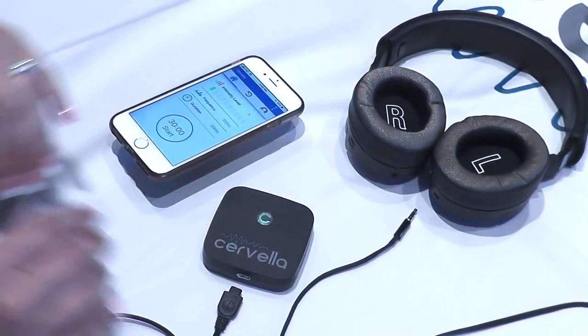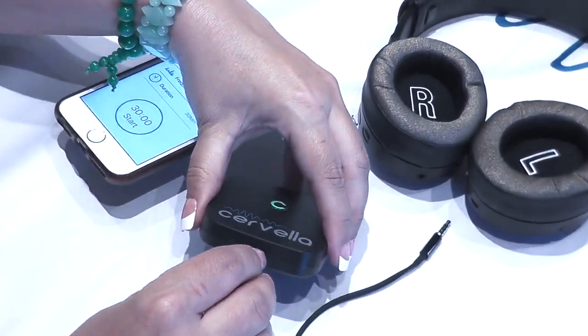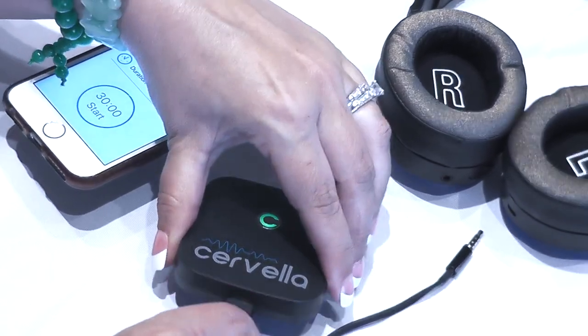Only apply the gel to the electrode area that will be in contact with the mastoid area behind each ear. Connect the Cervella device and the headset using the connecting cable.